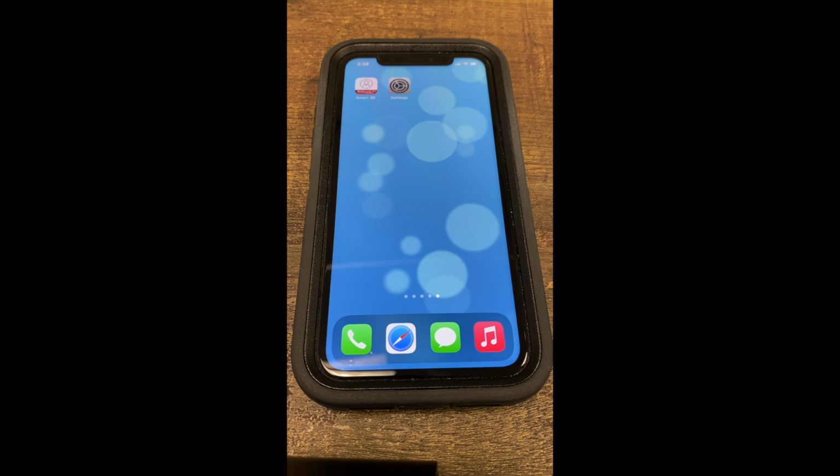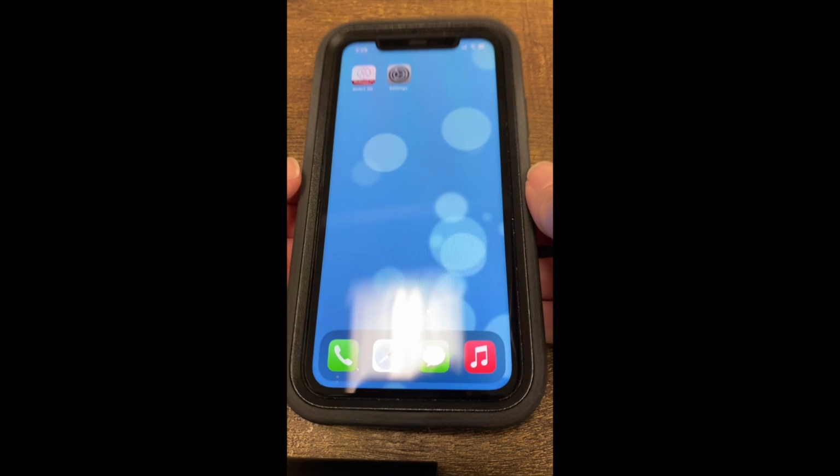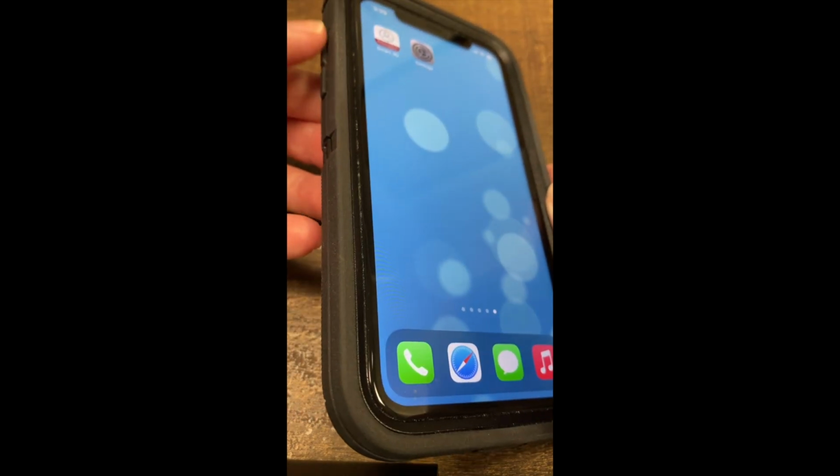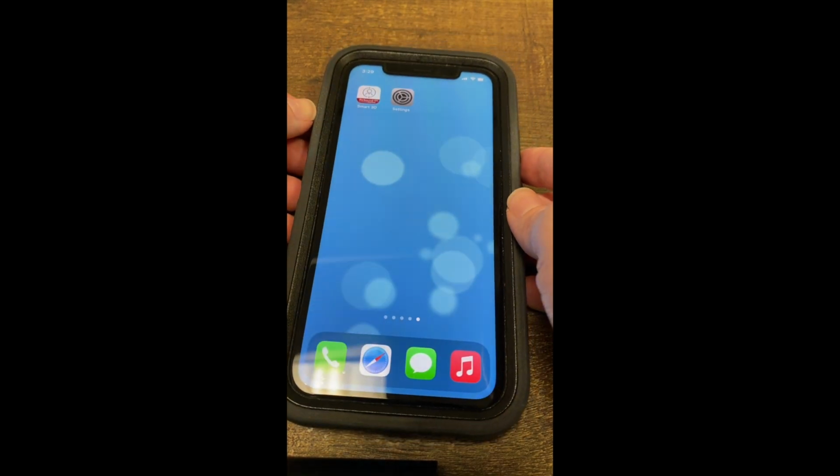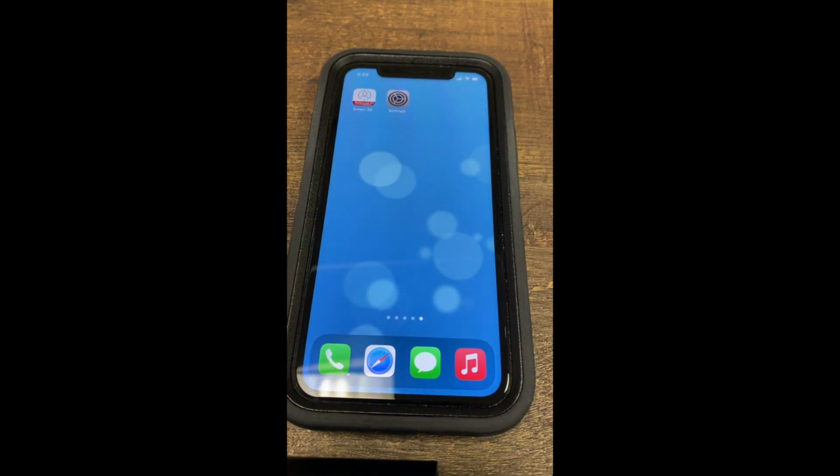Now if repairing the hearing aids to the phone does not help with the Bluetooth connection, the second thing that you'll want to do is go ahead and completely turn the phone off and back on. So if you have a newer iPhone, you would do that by holding the top button and the side button at the same time, pressing those together. That will completely turn the phone off. And then you would use those same buttons again to turn it back on.